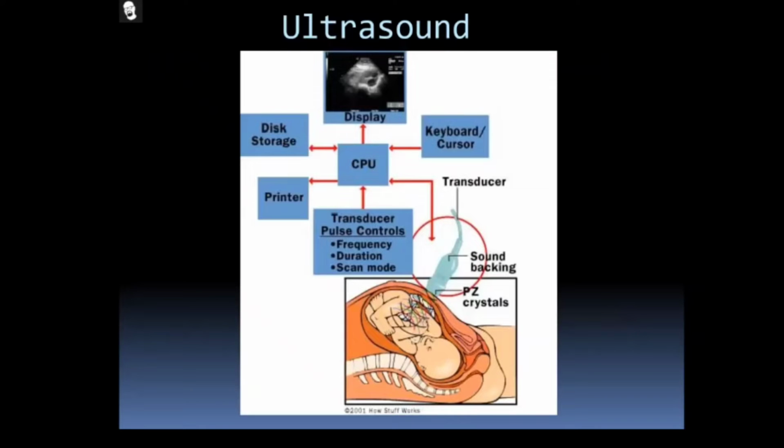First of all, the main part of the ultrasound is the probe. Through the probe only, we can diagnose the internal organs. The probe plays the main vital role in the ultrasound machine. If the probe is not functioning properly, the other parts of the ultrasound machine are of no use.